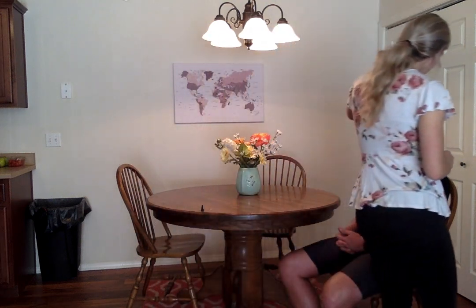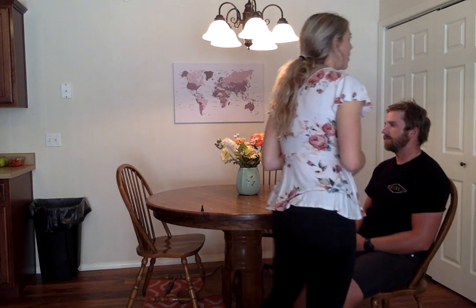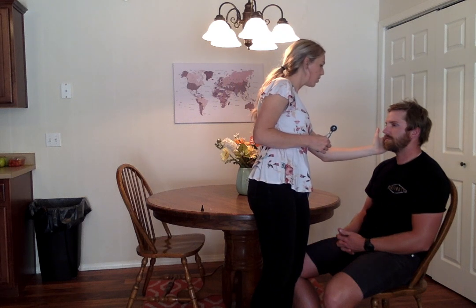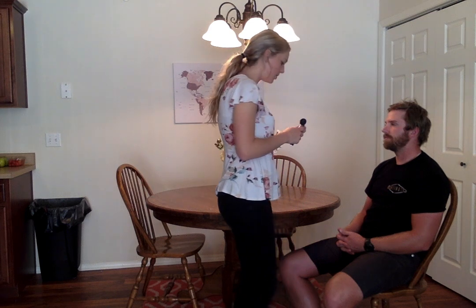With everything, I would start with inspection. I would look at the external structures, looking for any obvious lesions, any signs of infection, any drainage. Then I would do my whisper test. Just repeat anything you hear. Baseball. Baseball. Okay. Now I'm ready to use my otoscope and look inside the ears.